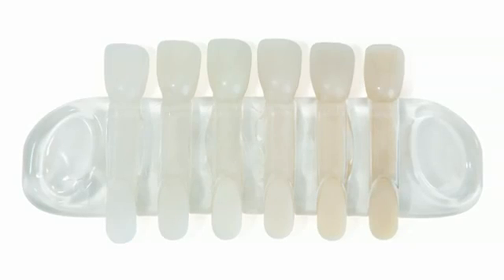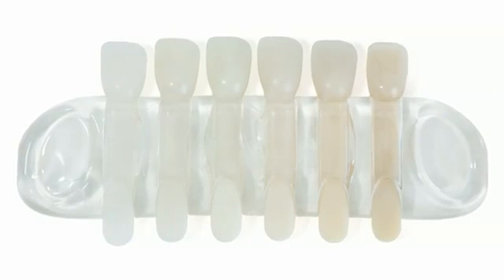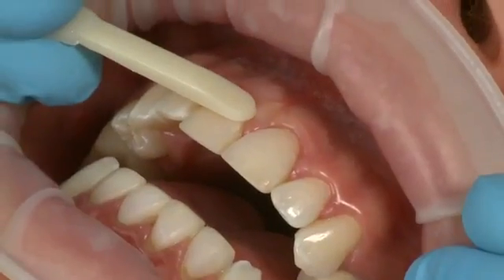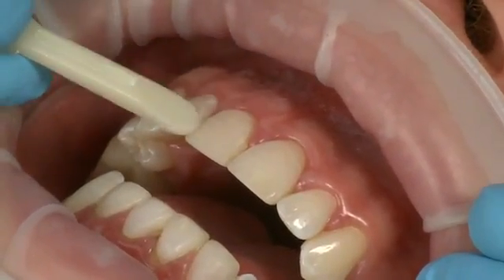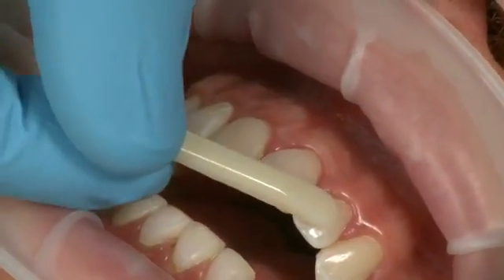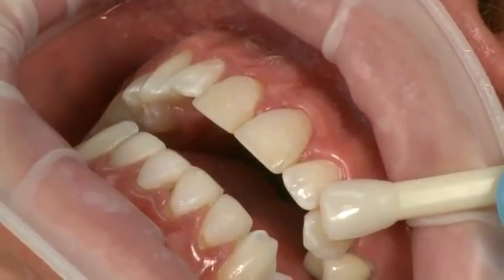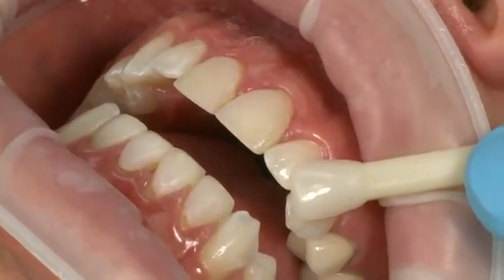Each Edelweiss composite kit contains six shades of Amelogen Plus composite. To determine the correct shade, use the dentin side of the provided shade tab to find the one that best matches your patient. Verify the shade using the veneer side of the tab.